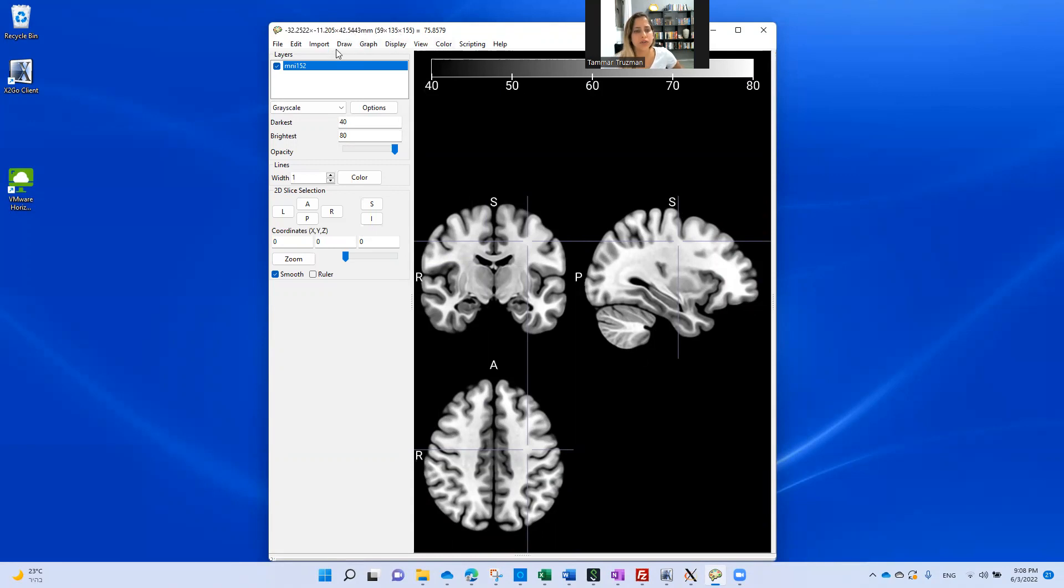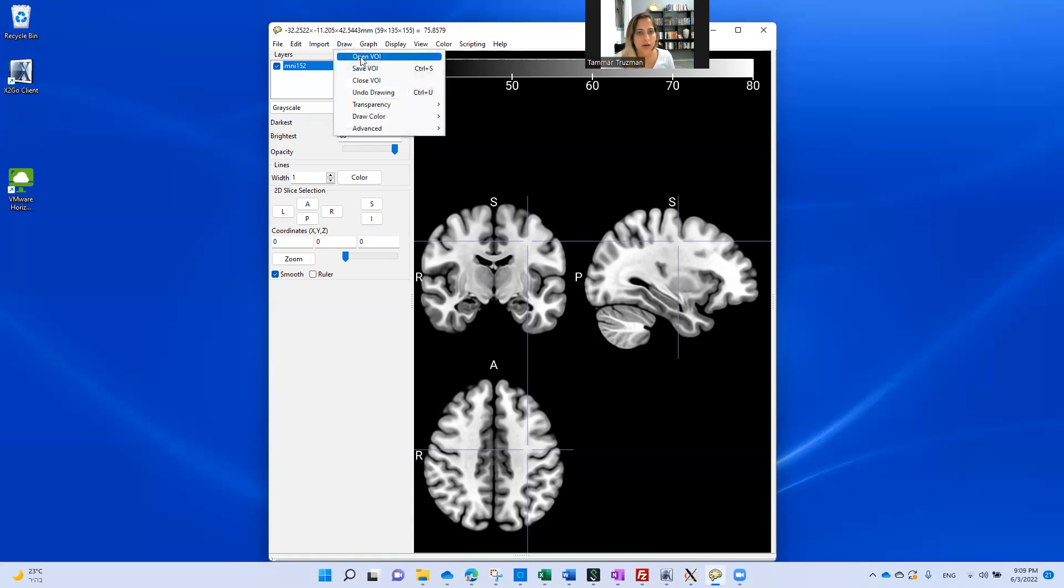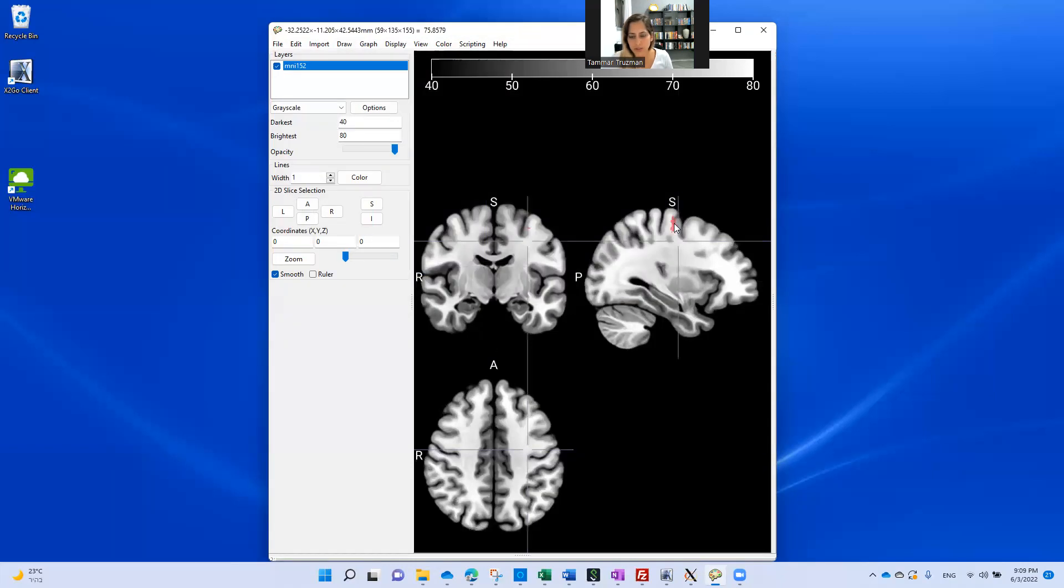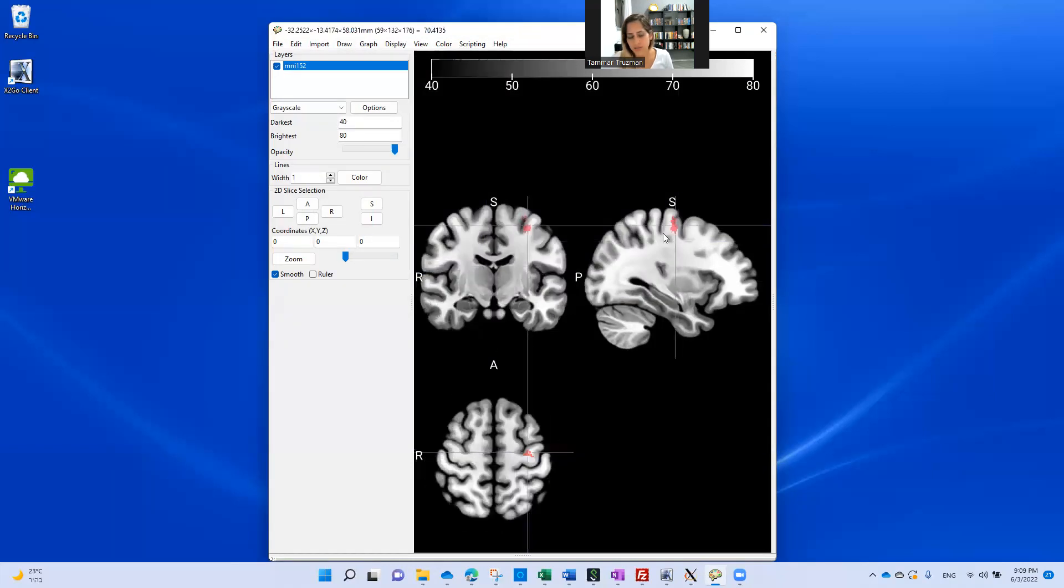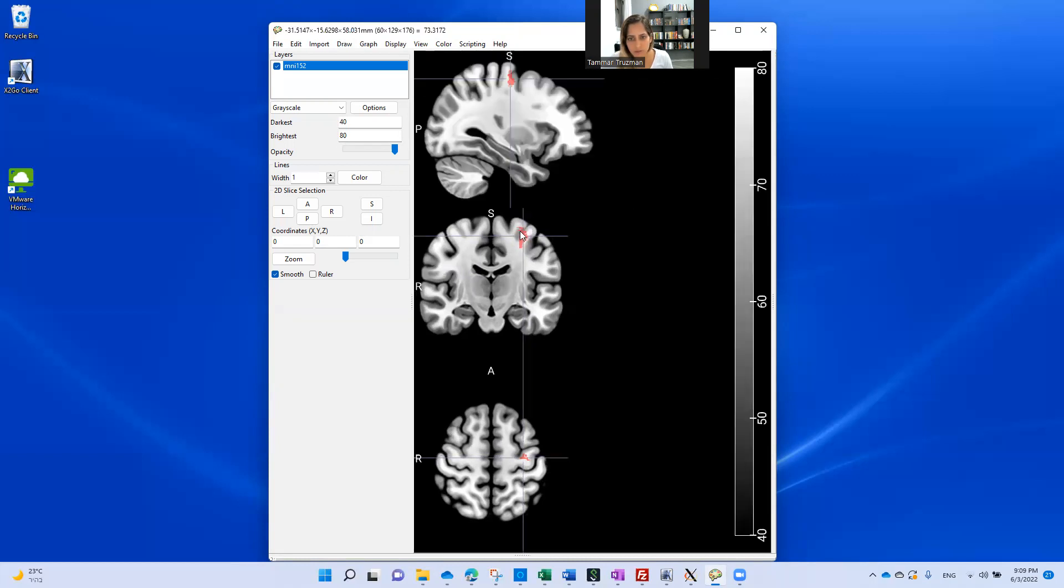Now I load one of my volume of interest. In my case, it is lesion maps. I have subjects with brain lesions, and I want to measure their volume of each subject lesion, and then I can compare between them. They have to be in the same dimensions and they have to be standardized or normalized to be in the same space, because that is how I can compare them. Now I go to draw, open VOI, and I choose this subject. You can see this lesion is pretty much small. If I stand in the middle or the center of mass of this VOI, more or less.